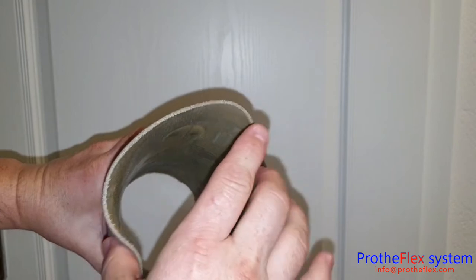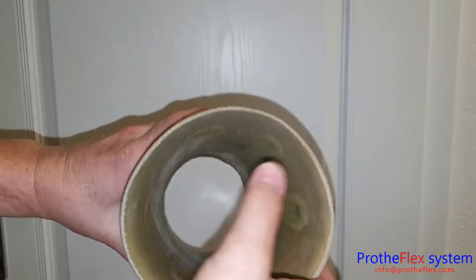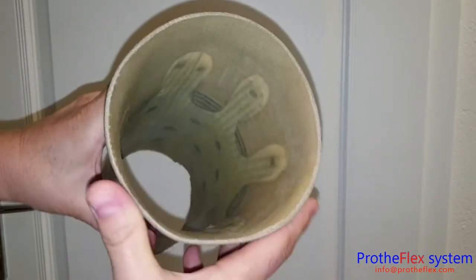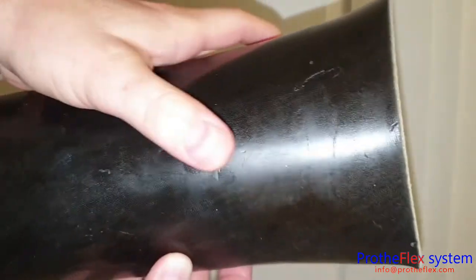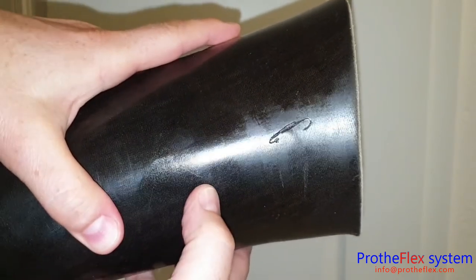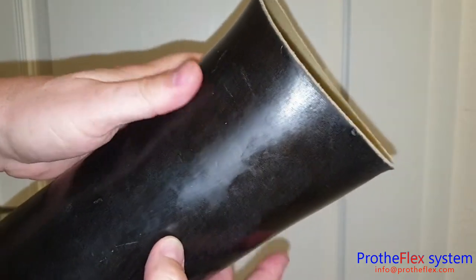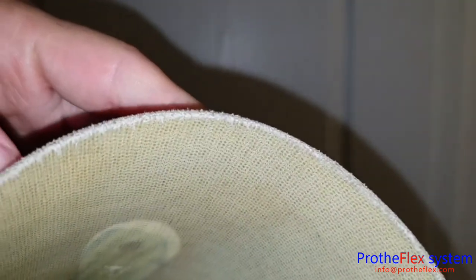The material really returns fast — while it stretches, it also goes back very quickly. It's actually a live material; it contains some oils inside, and these oils prevent the material from aging. You can see the edge is still in great condition.